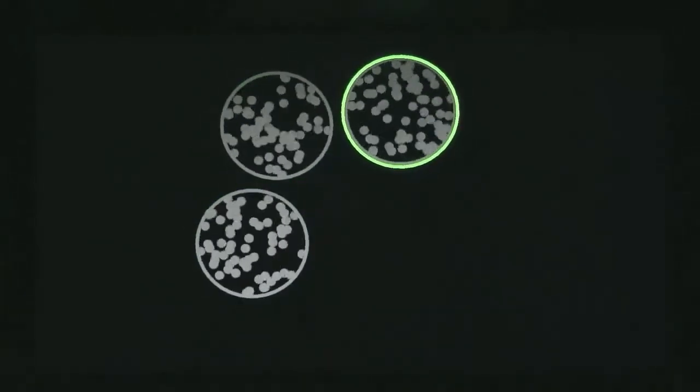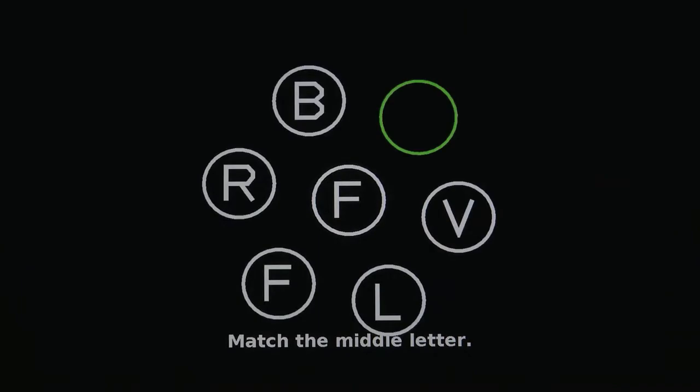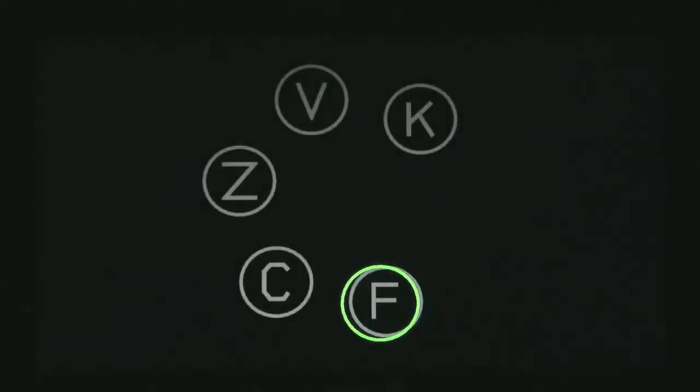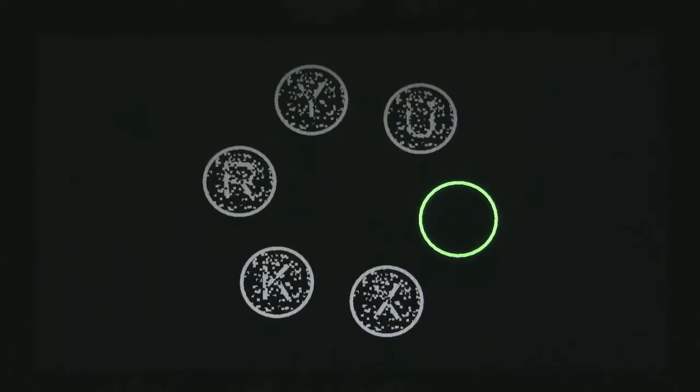The last 4 tests measure the patient's memory in the same 4 domains. Each memory test uses the patient's perceptual score from the matching domain to determine what level of perception the memory test presents. The letter memory test initially measures the patient's ability to immediately recall letters, and as the test progresses, they are presented with an increasing number of masking letters. This is a technique referred to as backward masking.